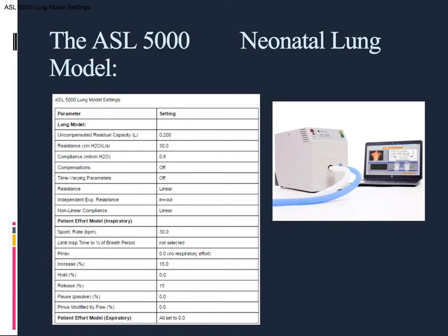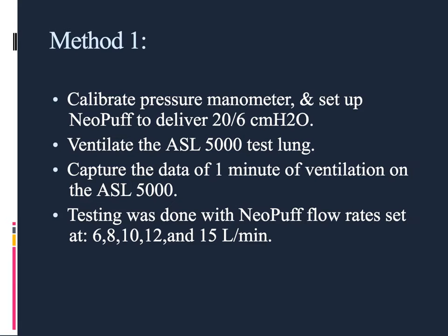You'll notice that in some of the next models I'll be talking about, we actually changed this, and we did measure very uniformly a patient's spontaneous inspirations and exhalations, and looked at that in comparison to other devices such as the servo-i ventilator and the CPAP.